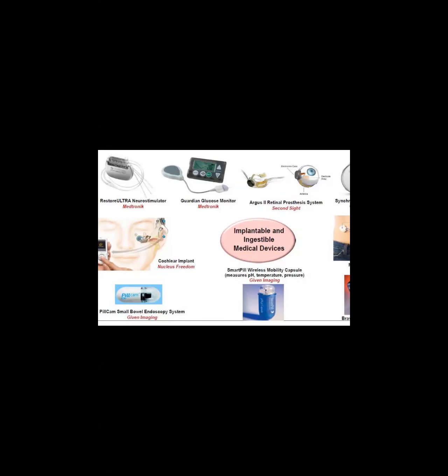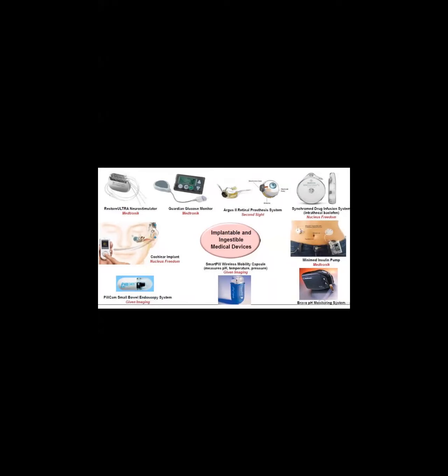These are all devices available at present in the market. They come under the category of implantable and ingestible medical devices that can be used to measure human parameters like blood pressure, glucose monitoring, cochlear implant parameters, neurostimulator values, and retinal values. We can choose Second Sight by using the retinal implant. The retina is most important for the human eye, so it can also be implemented in implantable devices. These are all the available devices in the market.